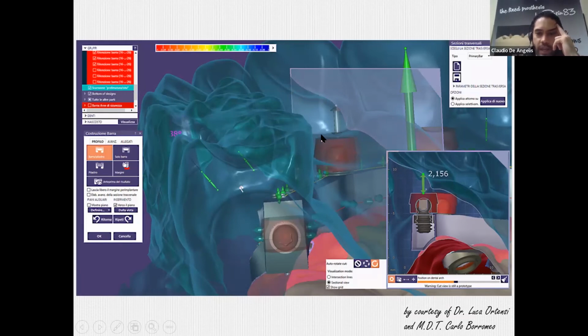You can see the denture in transparency, you can understand the space, the prosthetic space. Again, this is what you made before with a silicone key of the denture. Here you have directly the transparency of your denture. So again, the two things are true in real life and in digital life, okay?